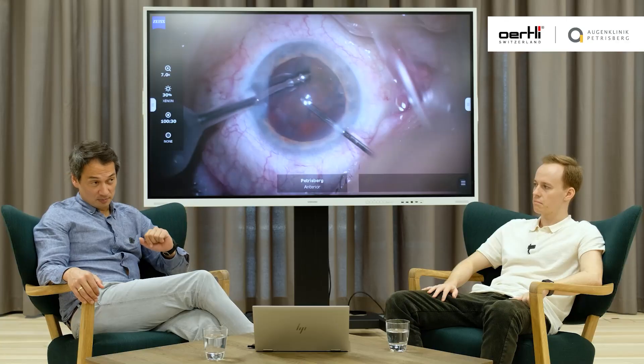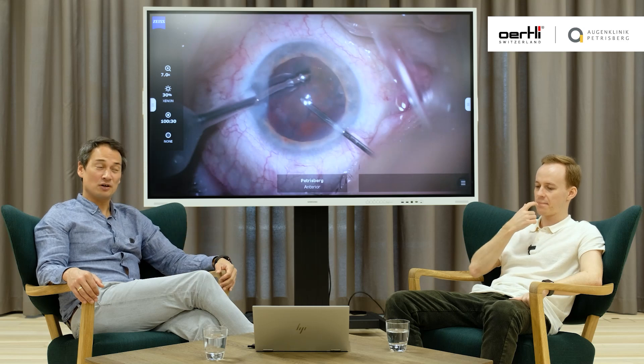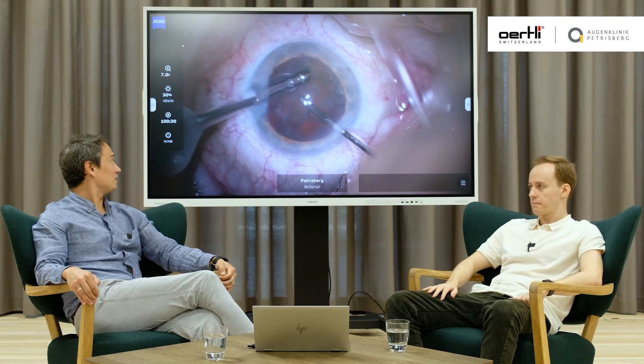Putting in OVD, to be honest, in many cases doesn't really save you from prolapsing the vitreous. But there are some cases where you can really preserve the diaphragm of the vitreous and not have vitreous prolapse into the anterior chamber. Those are the lucky ruptures — but those will not be the lucky ruptures you have in the beginning.